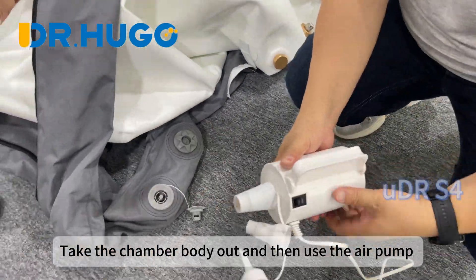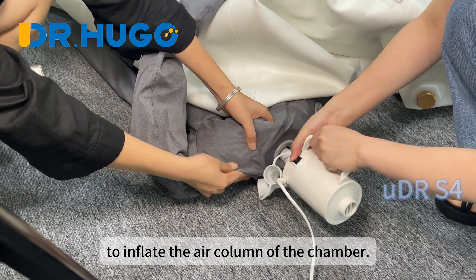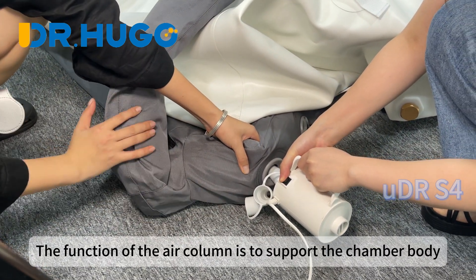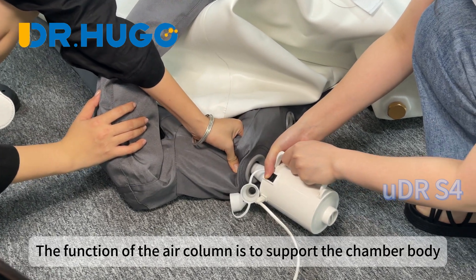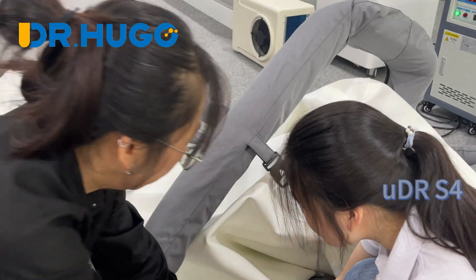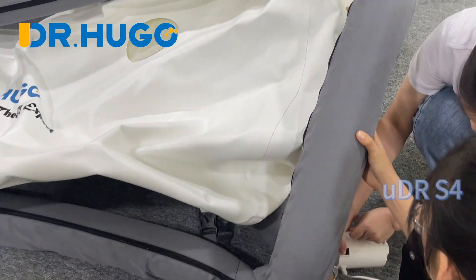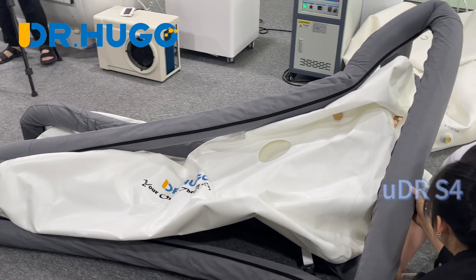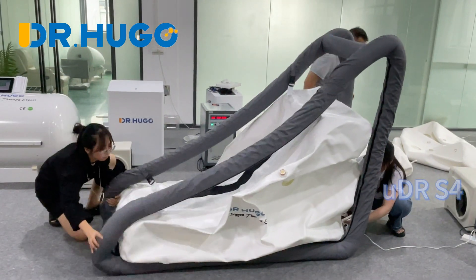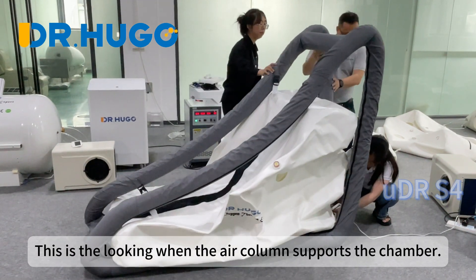Take the chamber body out and then use the air pump to inflate the air column of the chamber. The function of the air column is to support the chamber body and avoid moving. This is the look when the air column supports the chamber.